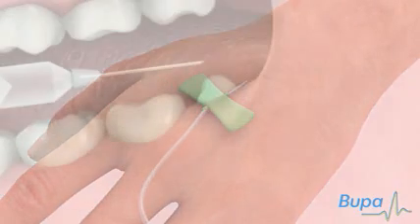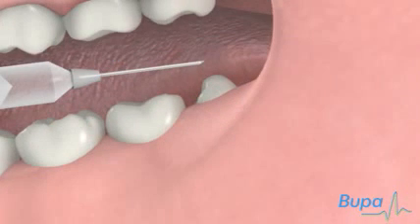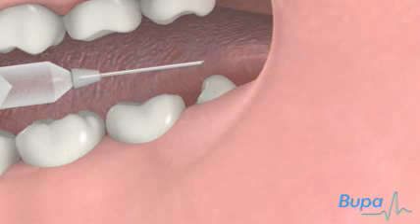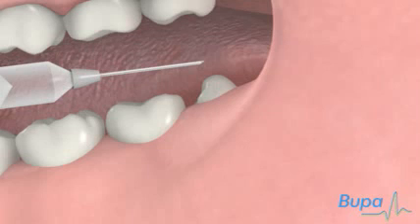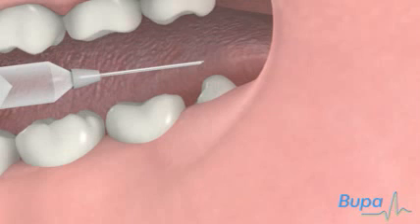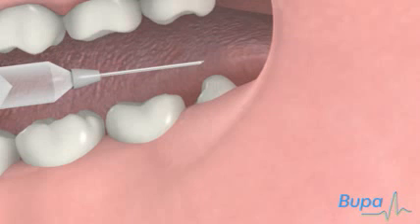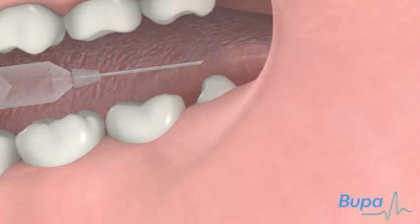Alternatively, your dentist may use local anaesthesia. This completely blocks feeling from the wisdom tooth and surrounding area. You will stay awake during the operation.